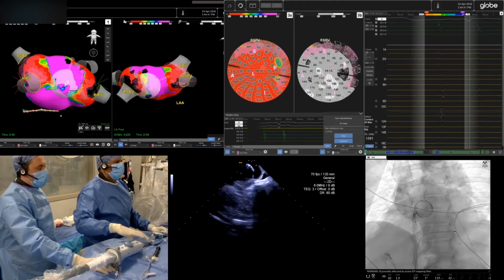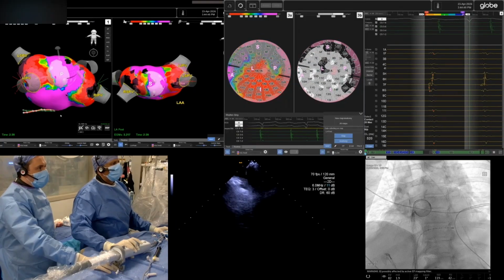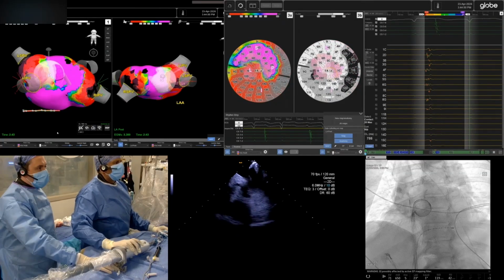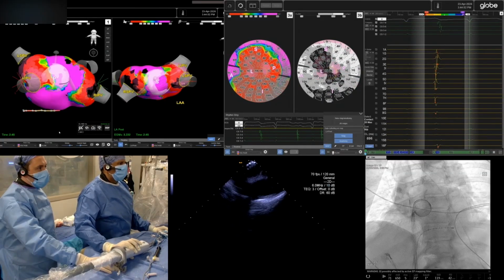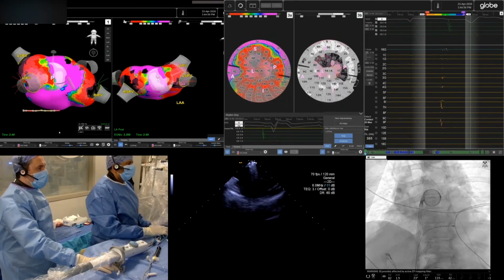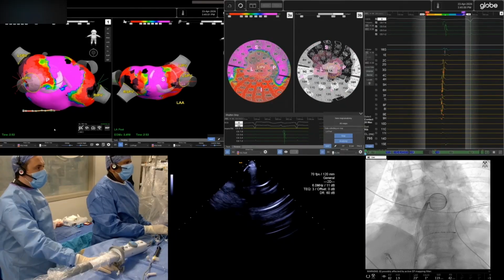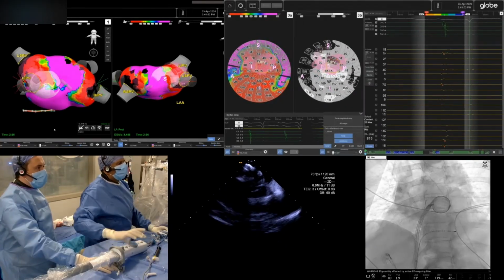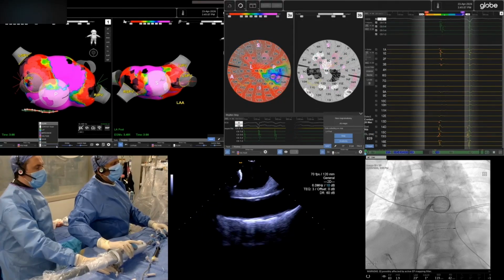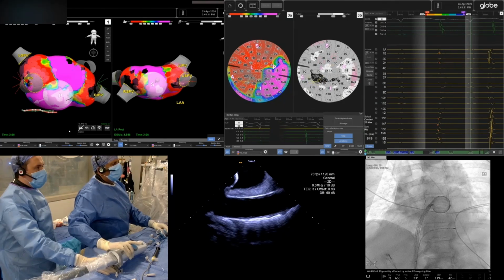Vijay? Vivek, what about the size? Do you think if the atrium is too small, it may be a little difficult? You know the size of this? This is the same as the cryoballoon. It just looks much bigger because you have this metal structure, right? But just to give you some idea of the size, it's big, but it's not that big. I think the only difference is that the cryoballoon, when we move it, is usually deflated, right? Yes, but you can deflate that, I agree.